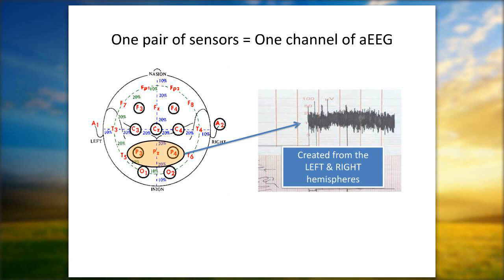We do have some data about C3, P3, and C4, P4. We know that moving the electrodes that little bit closer together actually creates a 1 microvolt drop in what would be the norm. So if you're looking at a C3, P3 or a C4, P4, and you have a microvolt lower limit of 4 as opposed to 5, that would be considered expected or normal when you're looking at a single channel. Perhaps by going a little wider, F3, P3, you're able to achieve the same distance as with P3, P4, and therefore they'd be more consistent.